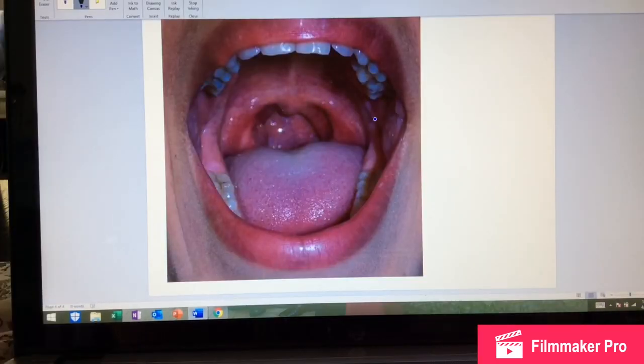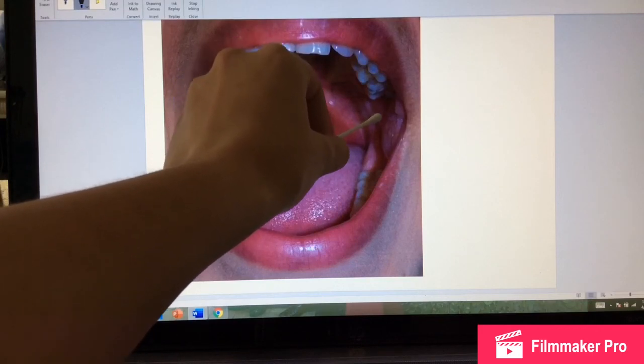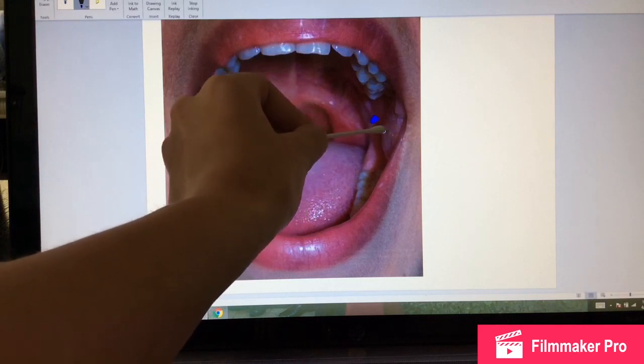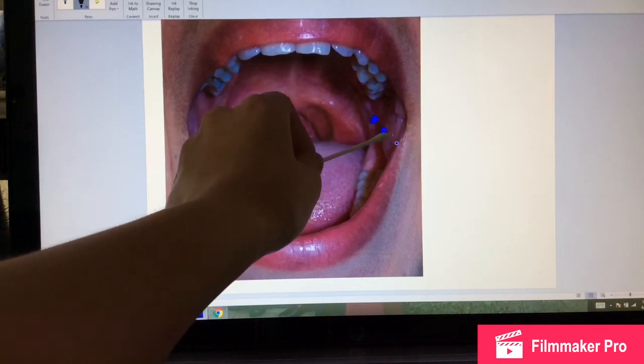Now we're also going to do the topical placement for tooth number 18, and we're going to do a mandibular block, or an IA block, inferior alveolar nerve block, and a buccal block next to that. The IA block goes right here in this area, and the direction is kind of how it is here, the Q-tip this way. And the buccal block is beside that, and it's going to be here in this area. So the topical anesthetic would go in this area.